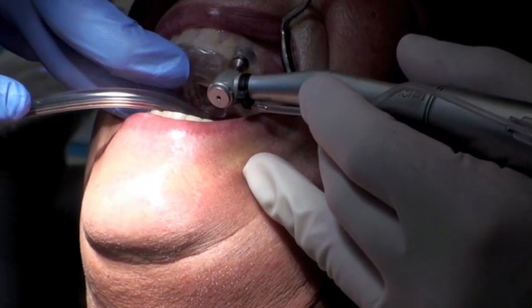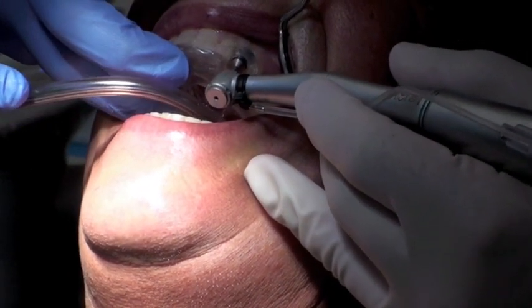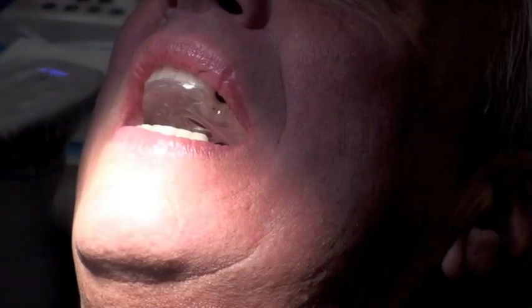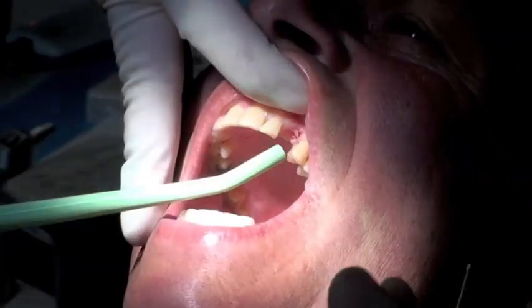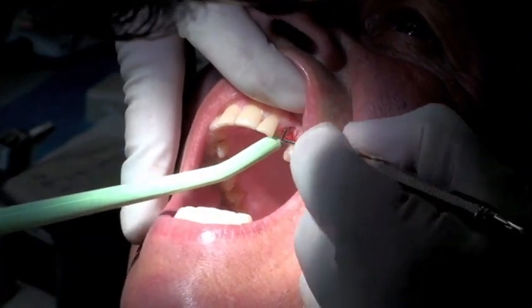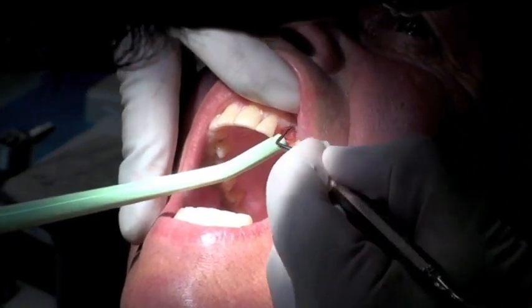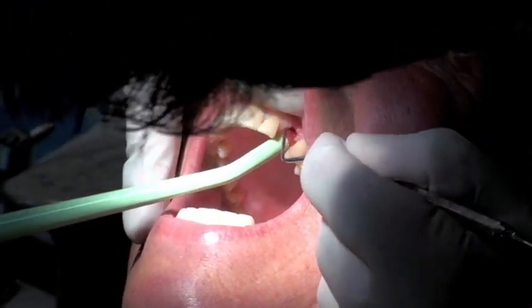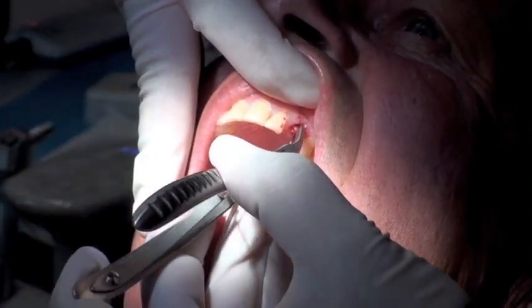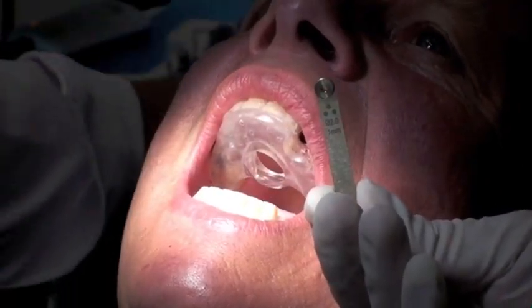In this case, this tissue punch comes with the Astra Facilitate kit. We're using an irrigated handpiece with sterile saline solution as irrigation. Once the tissue punch is done, the guide is removed, and the soft tissue plug is carefully removed. Salvin Dental has a curette that is sharp that can cut the base of the tissue plug for ease of removal. Rongeurs are used to remove that final tissue tag. The area is cleaned, and we can commence with the osteotomies.